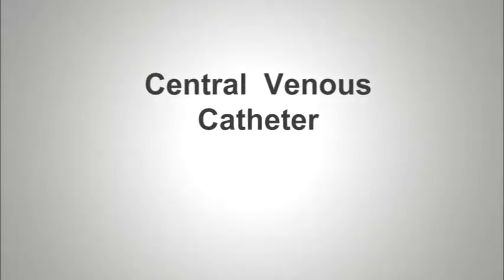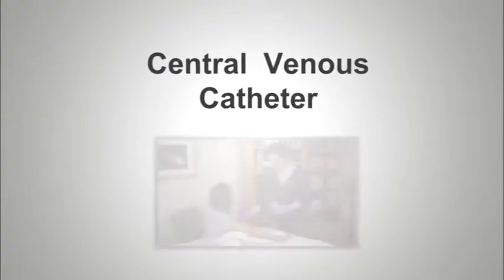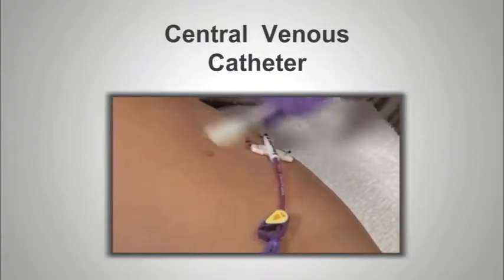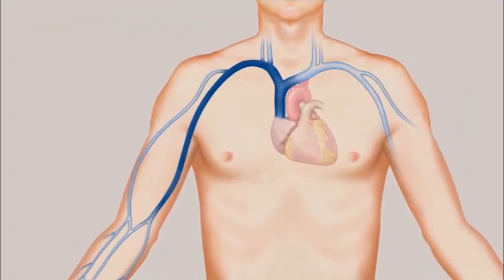You or your loved one have been told that you need to have a central venous catheter called a CVC. The purpose of this program is to teach you how to safely care for the catheter. This video supplements information you will receive from the infusion therapy team. Before we begin, let's take a look at the different types of CVCs.